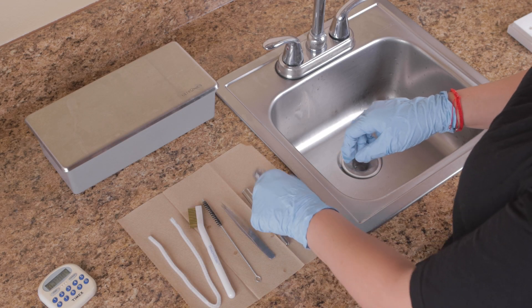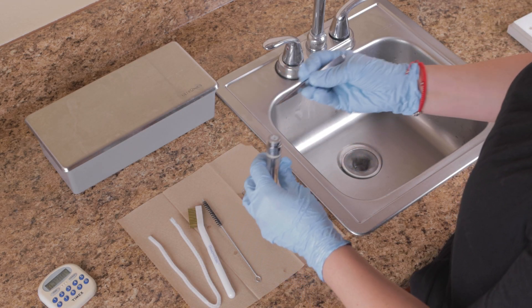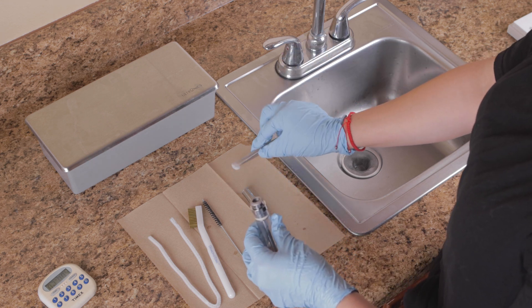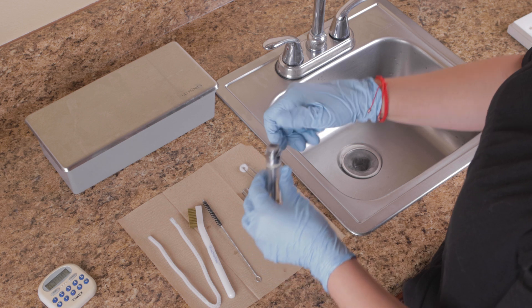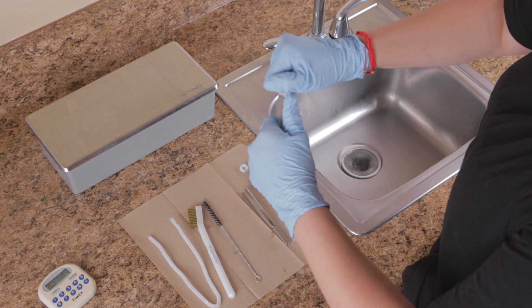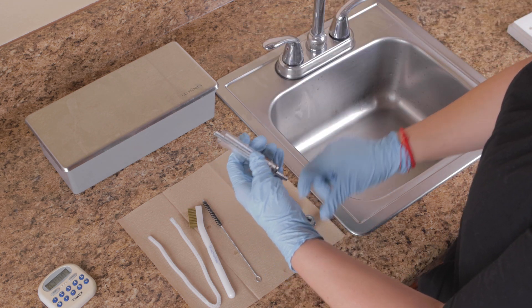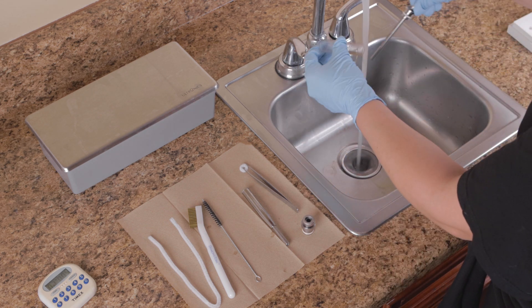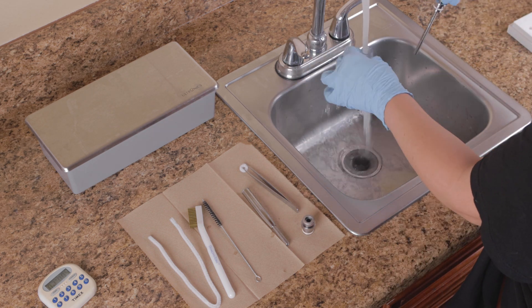To clean and disinfect the hydro wand tip, first remove the application pad from the tip of the hydro wand and dispose of it as a biohazard. Remove the tip and flow indicator of the wand from the plastic cylinder. Separate the tip from the flow indicator, dispose of any excess serum, and detach the plastic tubing from the metal stem.